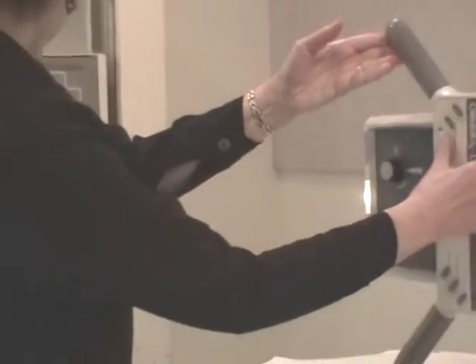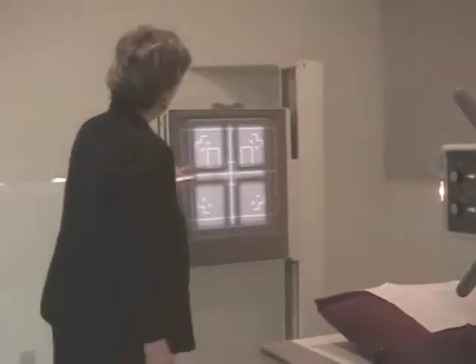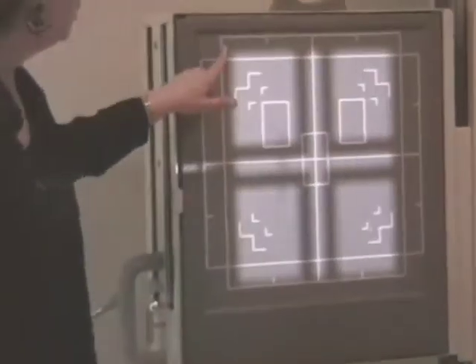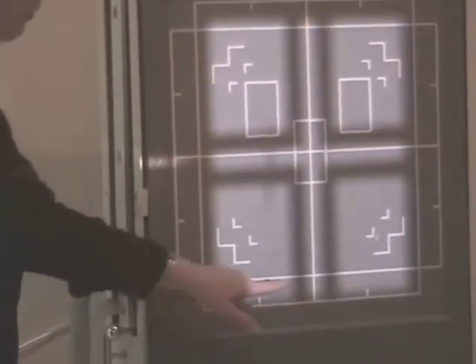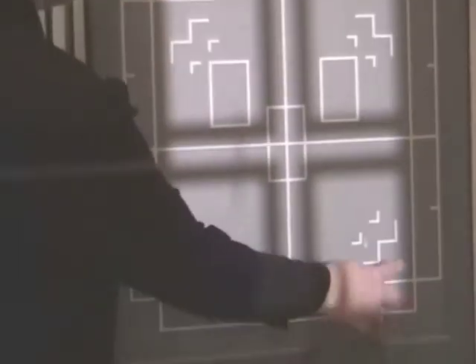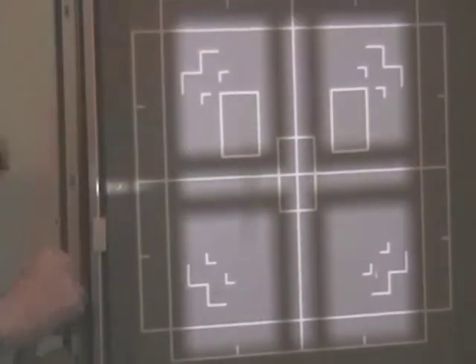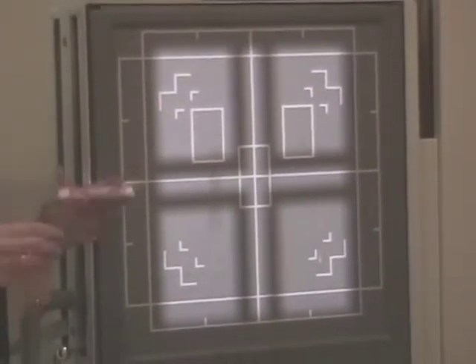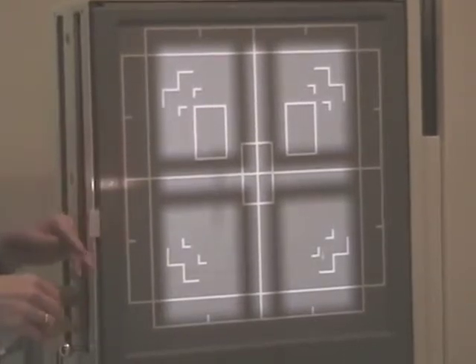And I center this line here in order for me to determine the amount of collimation. This is the 14 by 17 framework that we will be focusing on today, and the light needs to be just within those marks on this cassette.